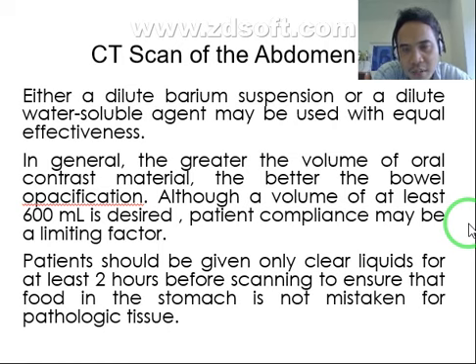But depende na sa pasyente, kung kulang pa ang 600 ml or restricted sila from taking too much fluid intake sa ilang body. Okay? Patients should be given only clear liquids for at least 2 hours before the scanning to ensure that food in the stomach is not mistaken for pathologic tissues.